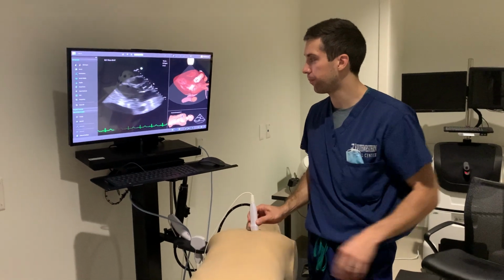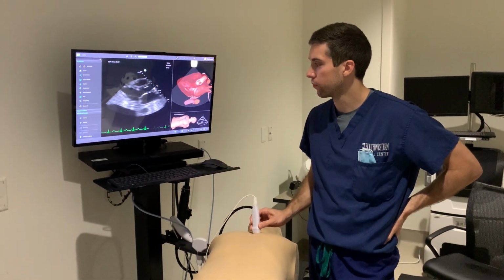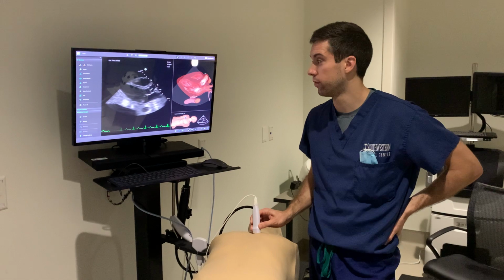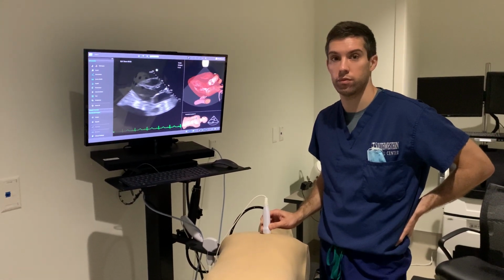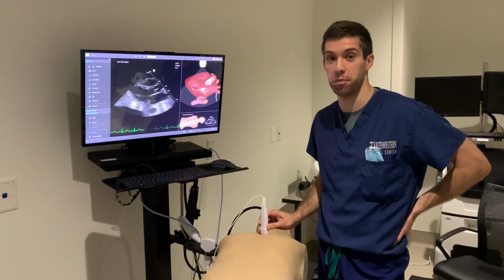There is a function called auto gain or optimization that most of the machines have that you can use to get optimization based on the computer algorithm. You just press the button and it makes it look a lot better.